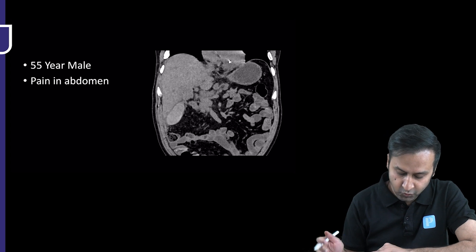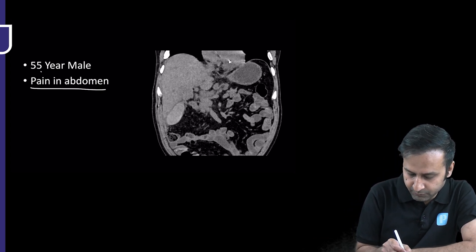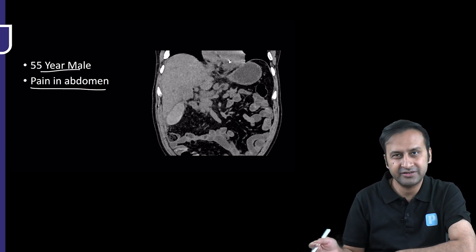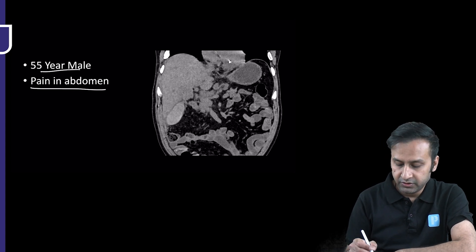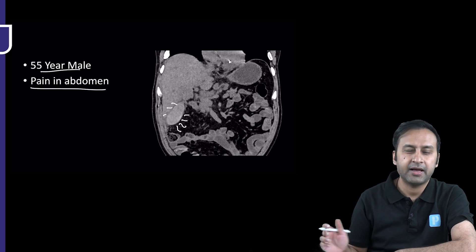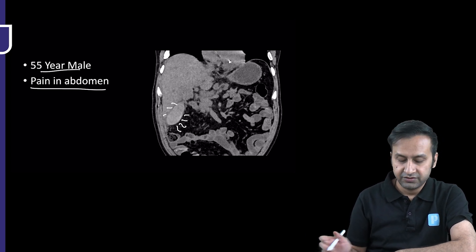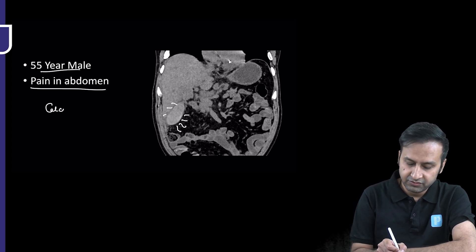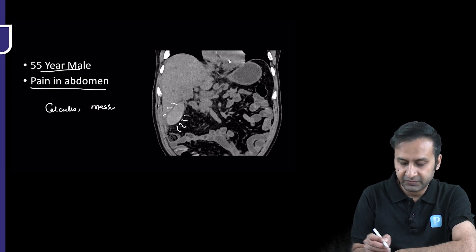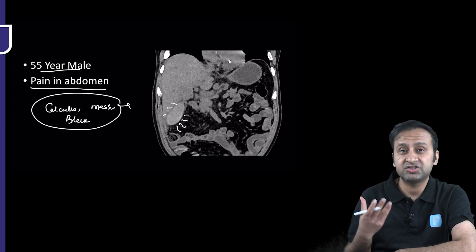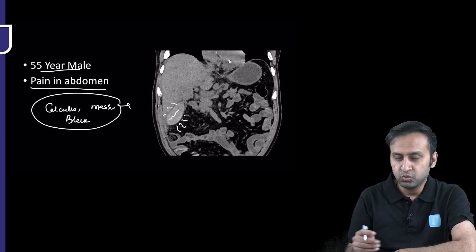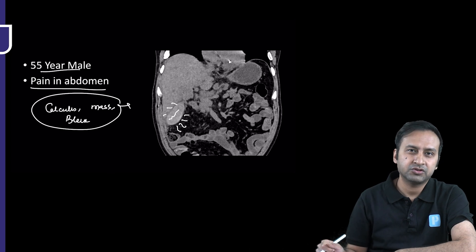This is a 55-year-old man who came with pain in the abdomen. The patient was sent directly for a CT, not for ultrasound. What do you see? The gallbladder is filled with something appearing hyperdense. What do you think it is — a calculus, a mass, or some form of bleed? These are the three things that come to mind when we see a gallbladder that is turgid, tense, and showing smooth hyperdensity.